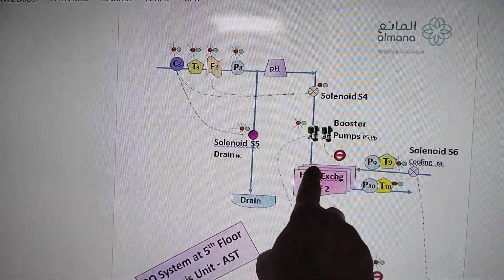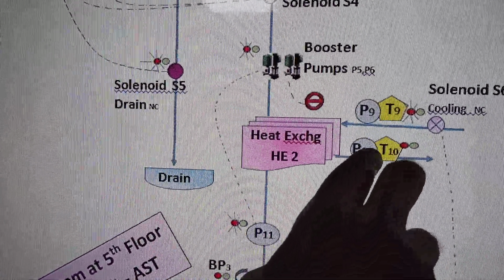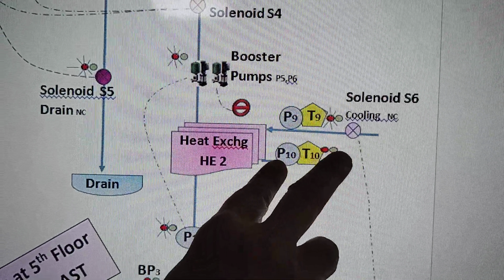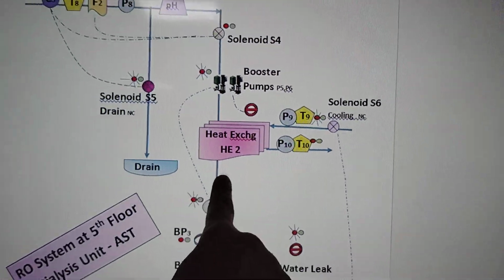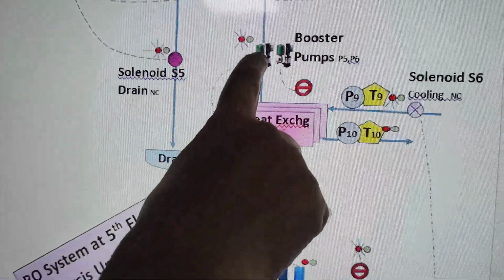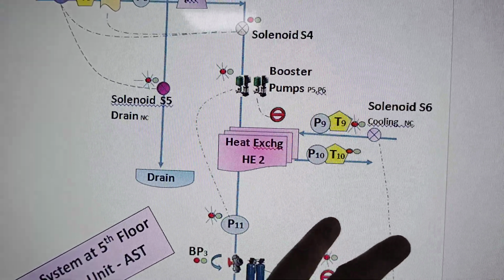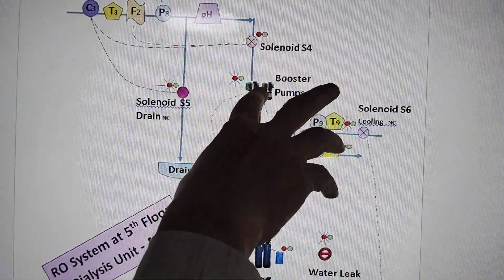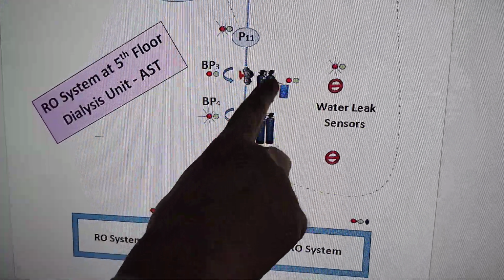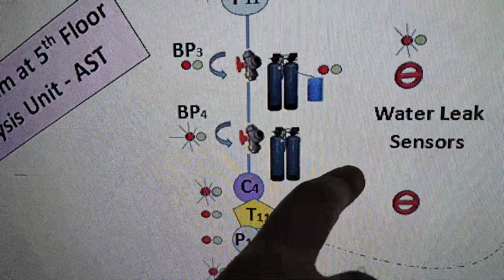And then the water passes through the heat exchanger, and here also it's monitored by input and output temperature, and pressure for the chiller line. So here we monitor the pressure. Once the pressure is built up, the booster pumps should maintain the pressure, and if there is any leak, it will switch off the pumps once again. And then it passes through the softener and then through the carbon filter.